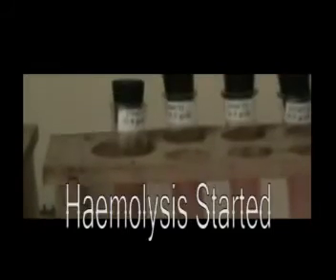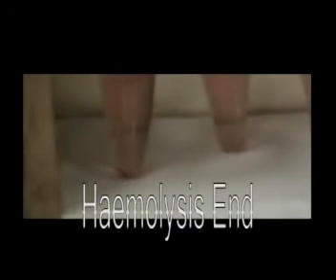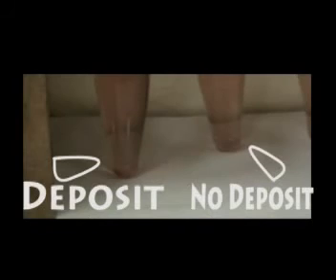Here you can see where the hemolysis starts and where the hemolysis ends. No deposited red cells at the bottom.